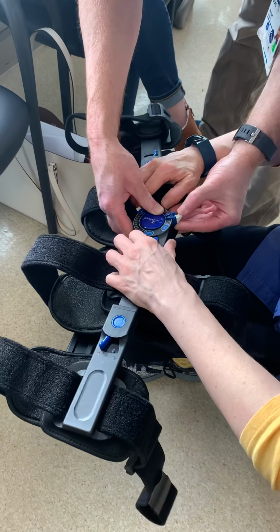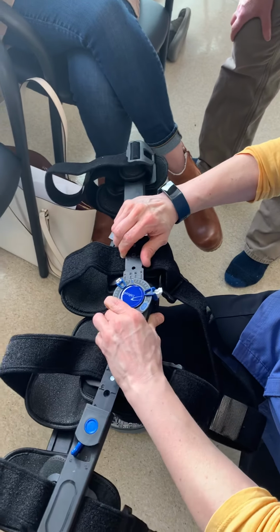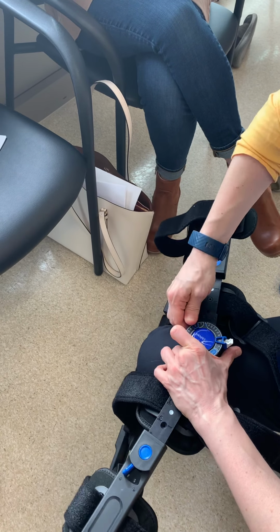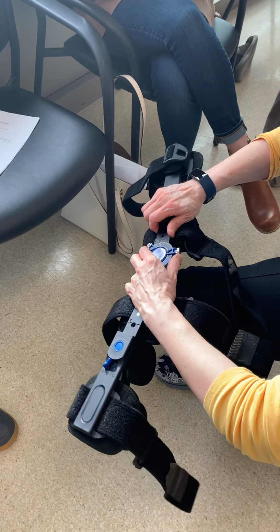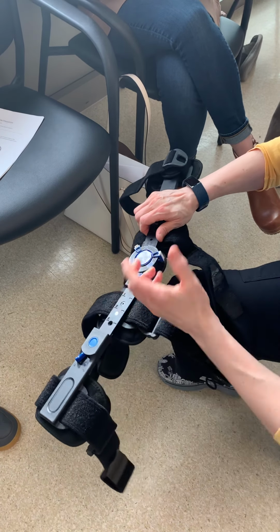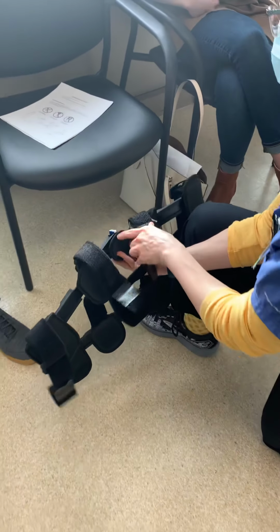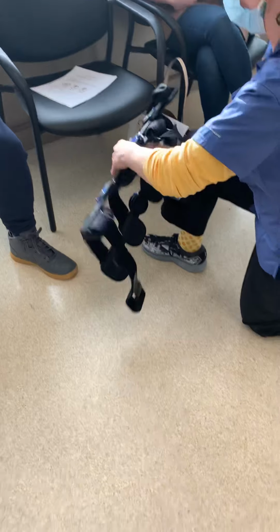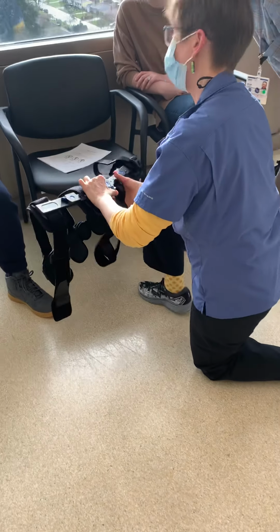This is always where it's tricky on these. You have to line up with the teeth just right, and sometimes you got to play with the hinge itself. So you notice how I kind of moved the hinge and it moved the switch back a little bit. So this is where that gets a little interesting. You have to kind of shimmy it in so it locks. There's these little teeth things in there that these switches are hooking into. So hopefully it won't provoke too much swearing when you have to do it.